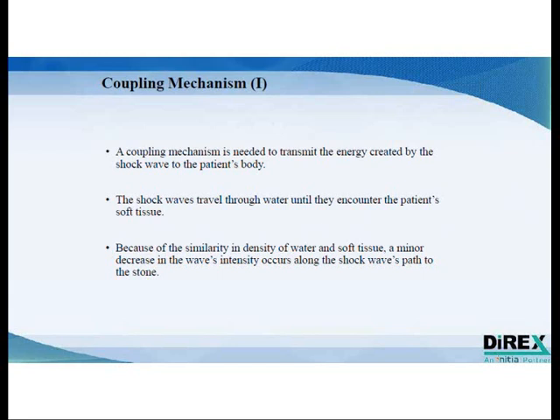The coupling mechanism, as explained earlier, consists of a membrane. The energy is transmitted from a water-filled medium through the membrane, through ultrasound gel to the patient's body.